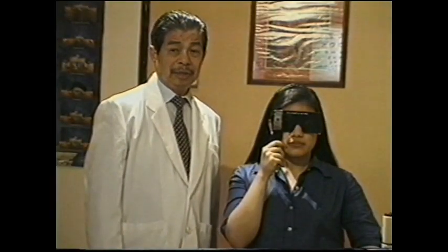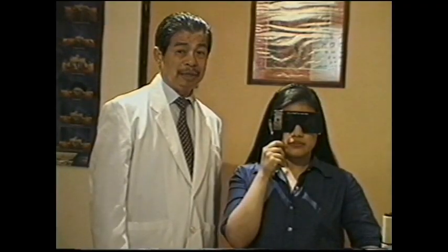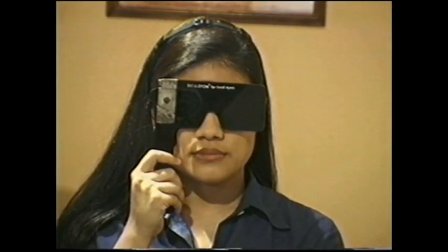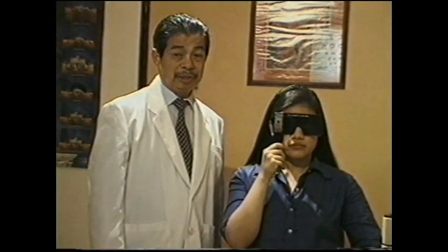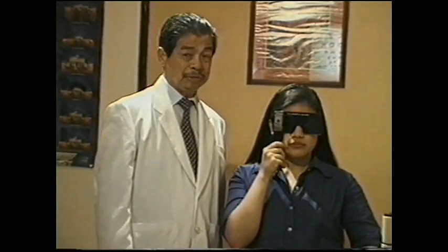Number 4. Instruct the patient to use small hand or eye movements to align the pinhole to resolve the sharpest image on the chart. Number 5. Ask the patient to begin to read the line with the smallest letters that are legible, as determined on the previous vision and without the use of a pinhole. C, K, D, and R. Number 6. Record the Snellen's visual acuity obtained and proceed with the abbreviation.